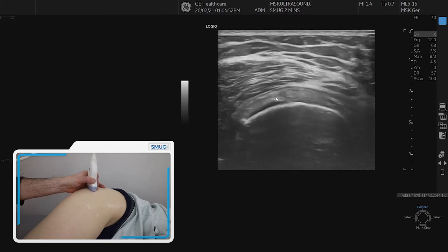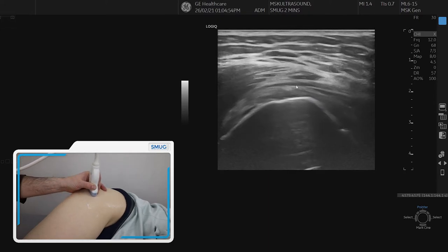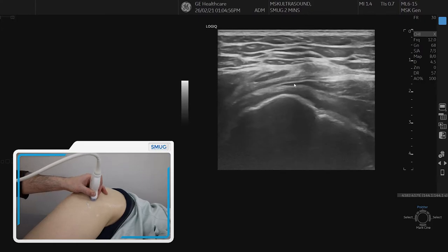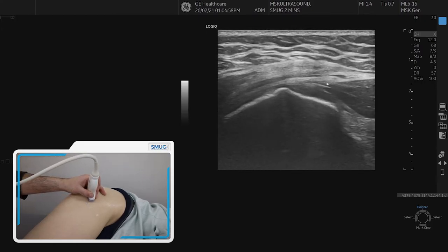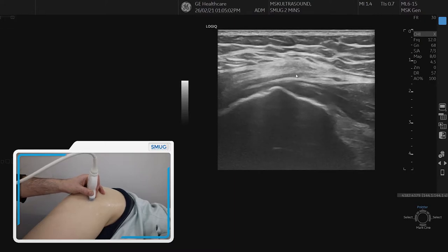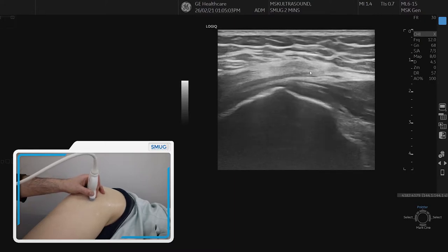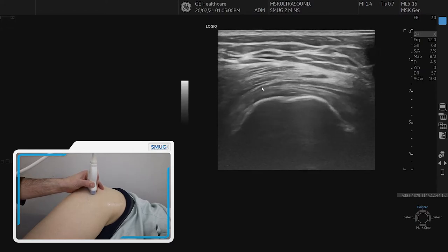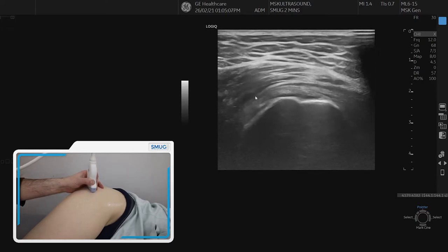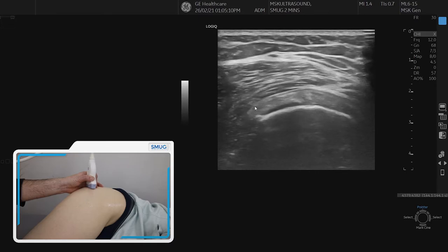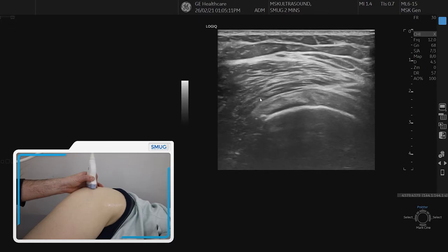I'll demonstrate in a minute when we do the dynamic test. So we go to the anterior part first. That's your anterior facet again. That's the fascia, tensor fascia lata on top, and if we go posteriorly you can see the two layers still on top, and here the muscular fibers of the gluteus maximus will be visualized.